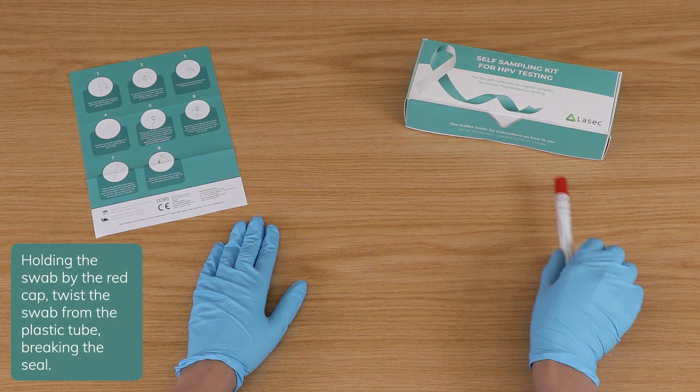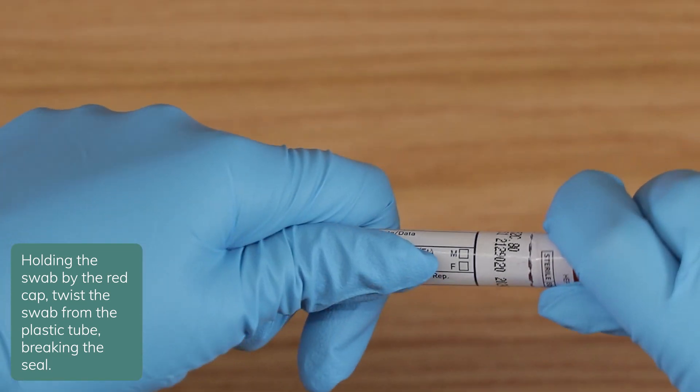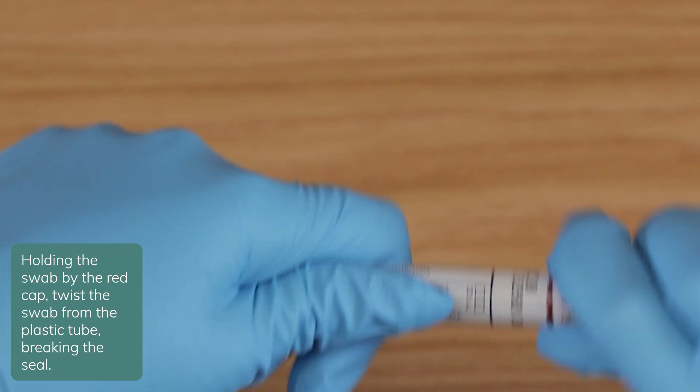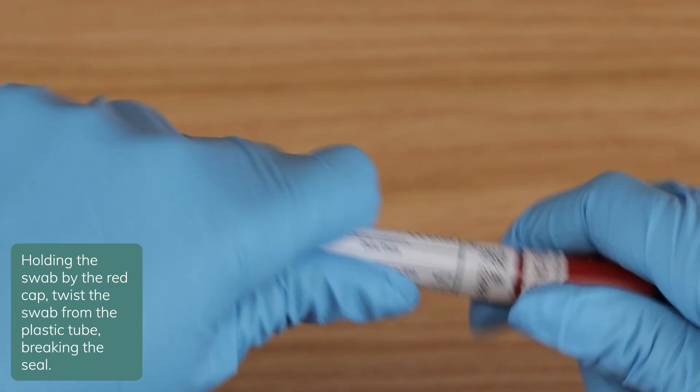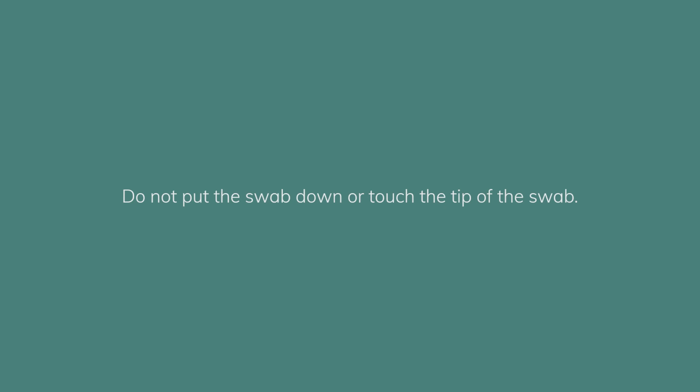Holding the swab by the red cap, twist the swab from the plastic tube, breaking the seal. Do not put the swab down or touch the tip of the swab.